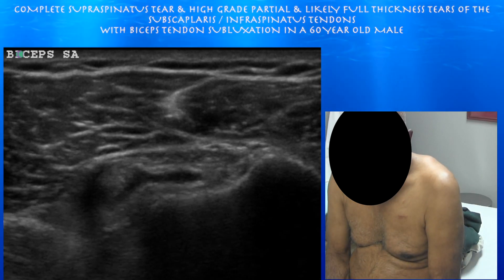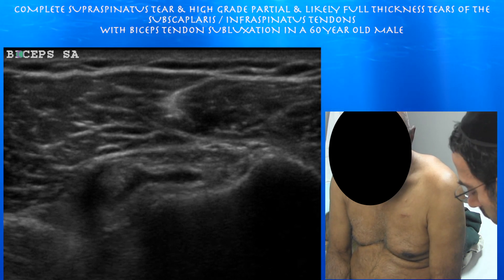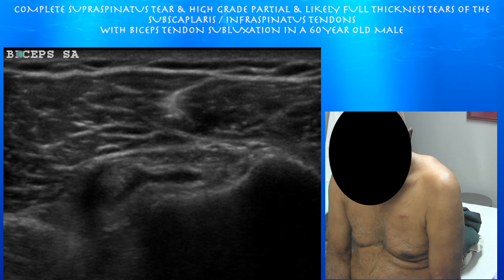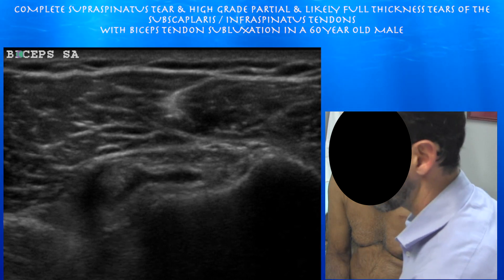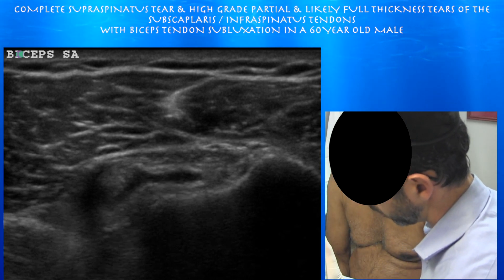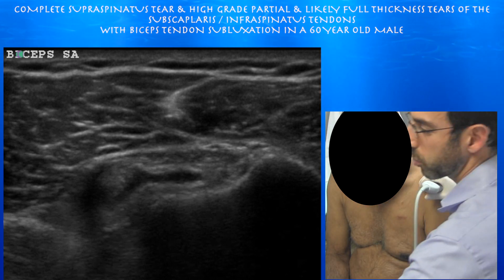A male presenting with pain in the left shoulder. About a month ago he was doing some heavy lifting, about 50 pounds, and has difficulty with motion in the shoulder. On physical exam he can only raise it to about 50 degrees in both abduction and flexion, with pain with any kind of resisted motion. He has a pacemaker so he can't get an MRI. We did an X-ray which showed a little bit of osteoarthritis at the acromioclavicular joint. So I'm going to go ahead today and just look at the shoulder.